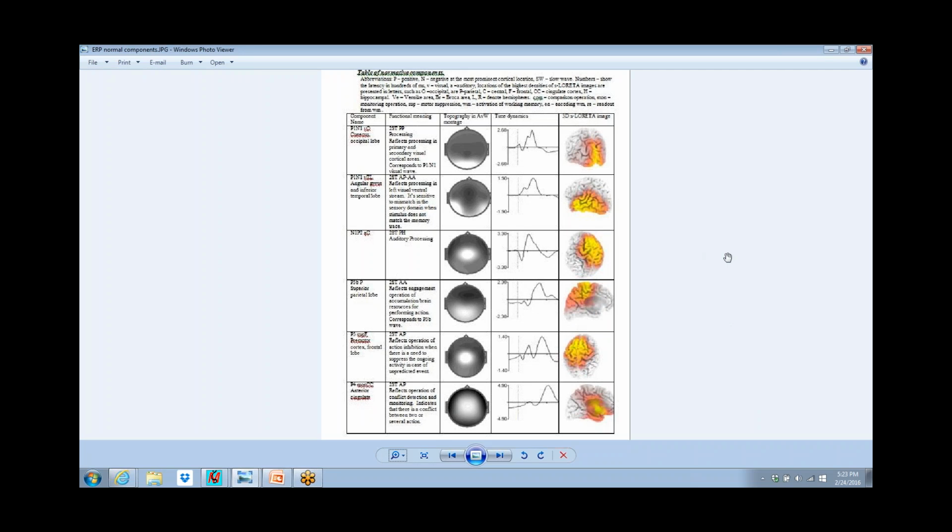at the background EEG rhythm, what's the standing waves of the background rhythm, what state does the brain hold, but you're actually looking at how that brain is processing information on a very specific task. Now, there are a lot of people that in QEEG do tasks, but the tasks very seldom have norms, and if they do, the task itself is usually very non-constrained.